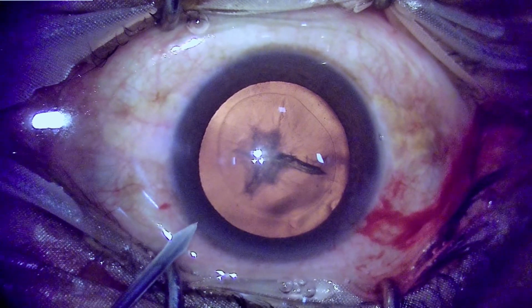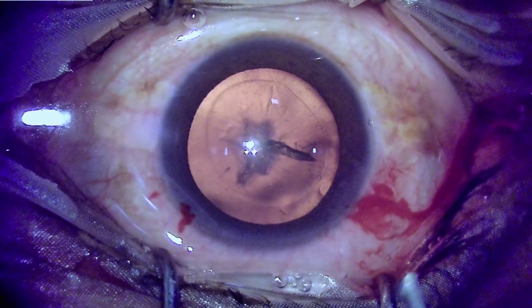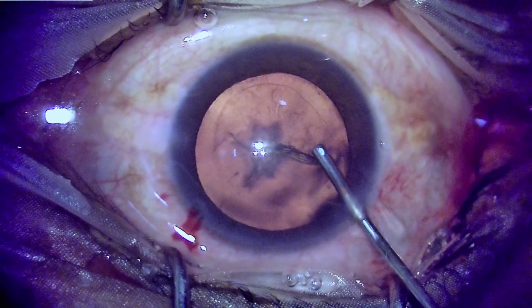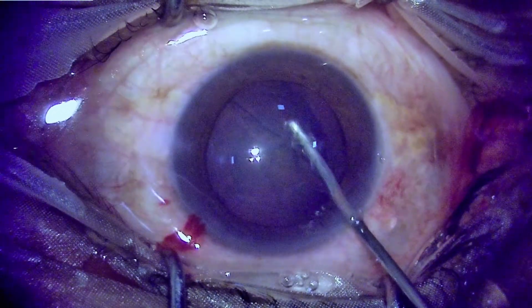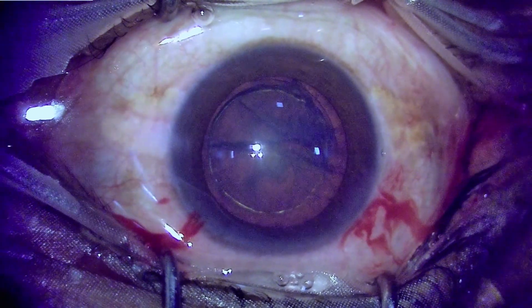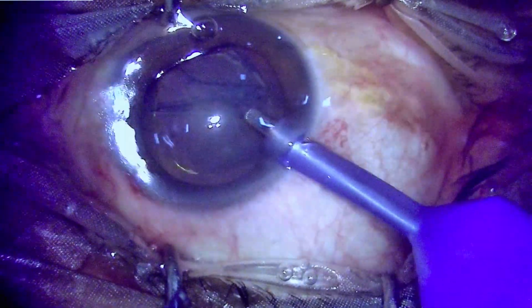Before that we will make a side port and do a hydrodissection. In these kinds of cases I always like to do a hydrodelineation, which defines the size of the nucleus and also separates the epinucleus, which makes the surgery and manipulation of the nucleus easier. So hydrodissection followed by hydrodelineation, which will define the nucleus in the form of this golden ring. We can see it's a grade 2 nucleus, not very large, not very hard. So we'll proceed for phacoemulsification now.